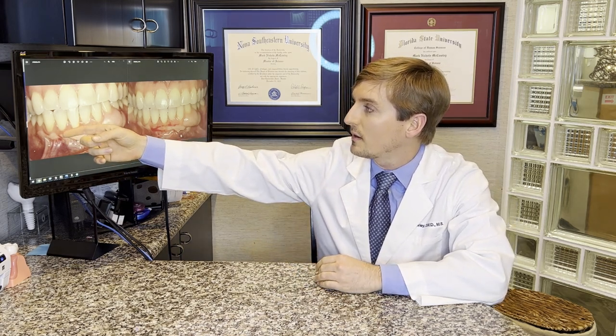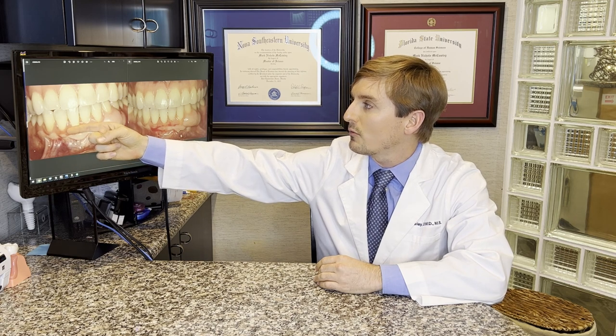I've got a case I'd like to show you — basically they came in and had some recession on a lower incisor, lower tooth down here. They previously had lots of gum grafting done, but that didn't cover the root and she wanted to get that root covered. So what we did was the pinhole surgical technique, where we're actually able to pull the gum up, thicken it up, and make it adhere to that root right there.